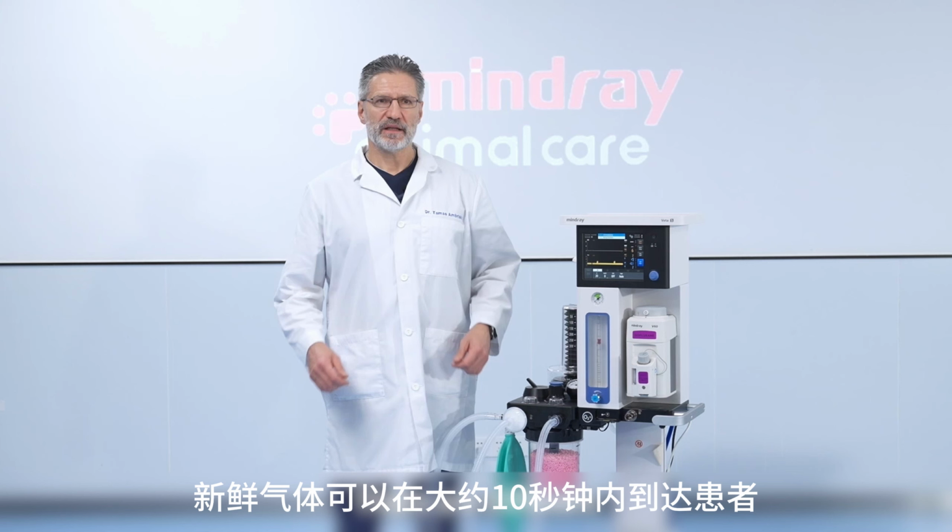The rebreathing system is different though, because fresh gas flow in the breathing hoses is intermittent. Fresh gas is only flowing in the breathing hoses when the animal is actually breathing, and during an apneic period, fresh gas is not flowing. So if this is the inspiratory hose, the new fresh gas from the machine will have to reach the patient, and it has a certain time lag, and the time lag depends on the minute volume of the animal, because the patient actually has to breathe through the volume of this inspiratory hose.